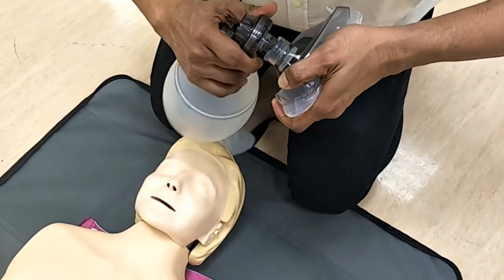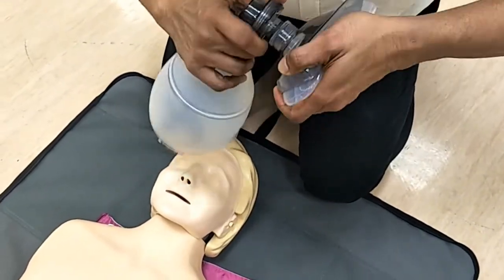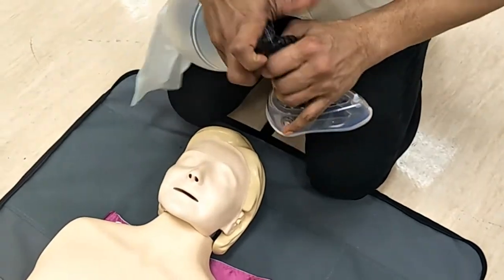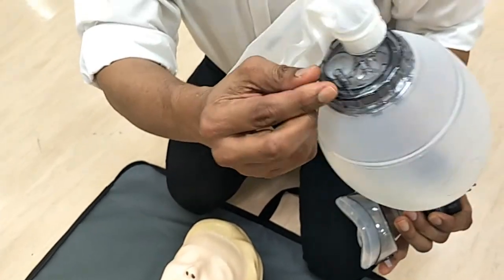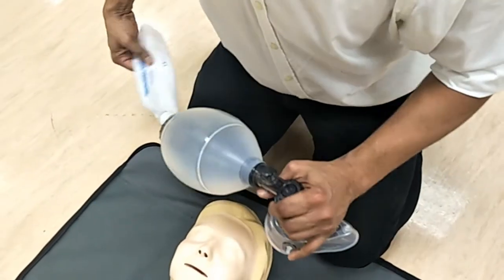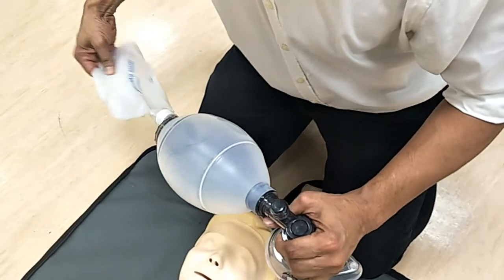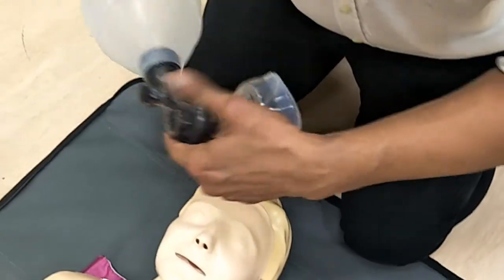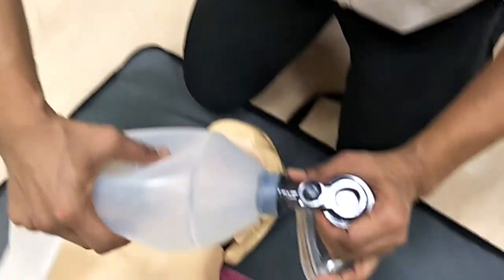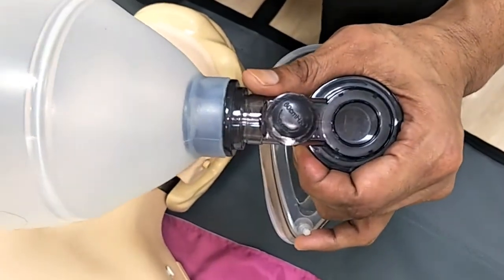Once you have sized the mask, attach the correct sized mask to the Ambu bag. The bag should be connected to an oxygen supply of 15 liters per minute via the oxygen port. Check to see that the reservoir inflates after connecting to oxygen supply. Also check that the valve opens upon bagging the self-inflating Ambu bag.